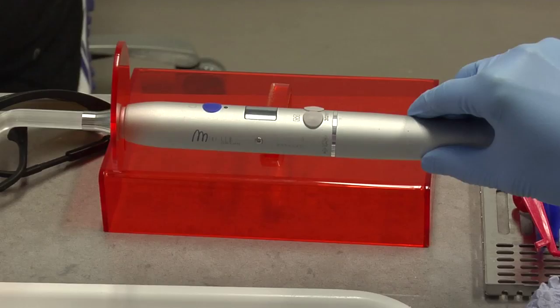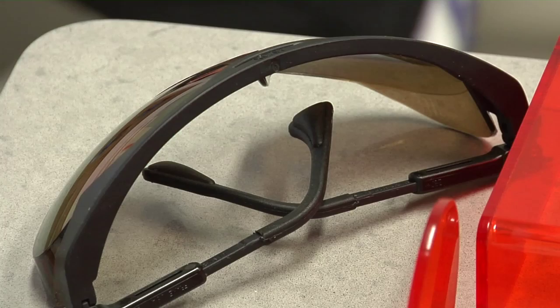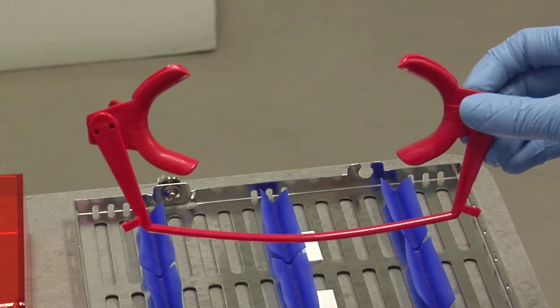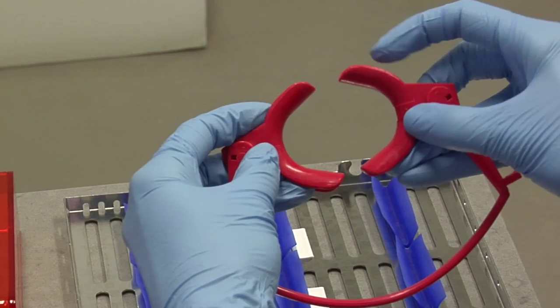And here are safety glasses to protect your eyes from the ultraviolet light and the materials that we're using. Over here we have a mouth prop. It's really important that the teeth stay dry in order for the glue to stick. Therefore, we use this tiny little mouth prop to hold the mouth open.